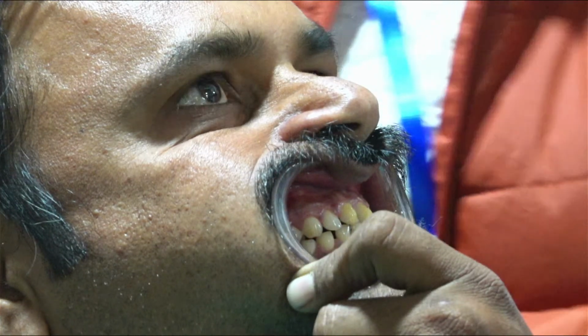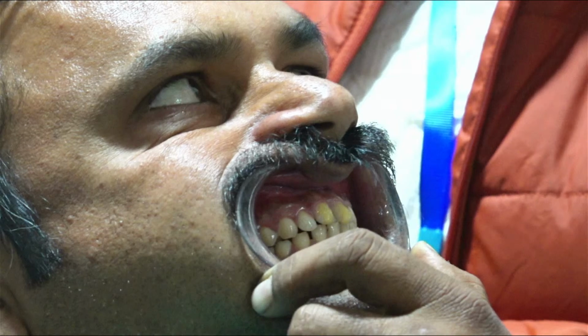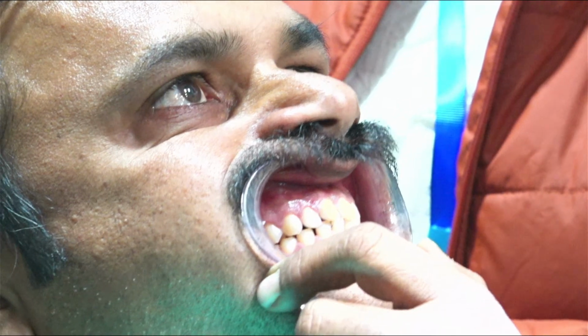if I want to cut the tissue, I will start with 2 watts, or I have the option of 2.5, 3 watts. So 3 के बाद अगर मुझको 4 जाना है तो I will go on incrementally. Now I will start it.